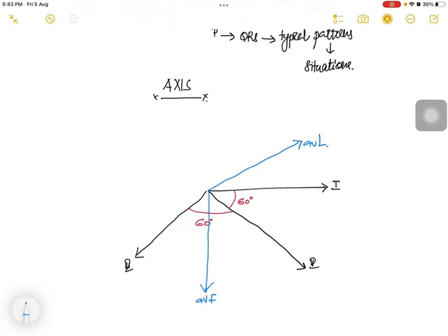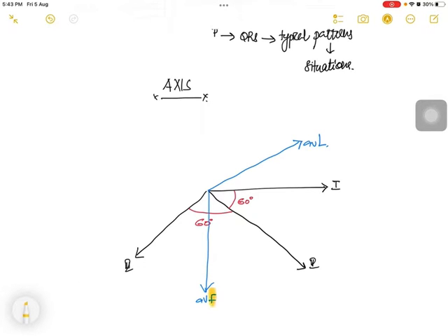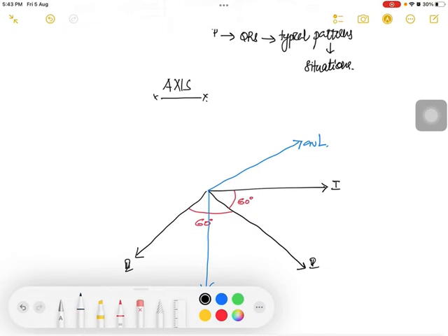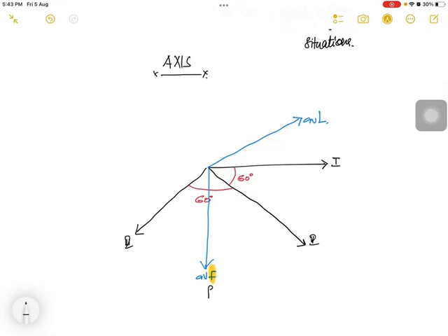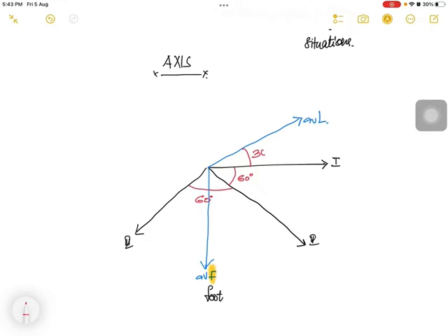How do you remember AVF, or know that AVF is the lead pointing down, relative to leads 1, 2 and 3? Simply the word F. F simply points to foot. So the axis is 90 degrees. You can remember it like that. The relation between the axis of lead 1 and AVL is 30 degrees. So you get it, right?